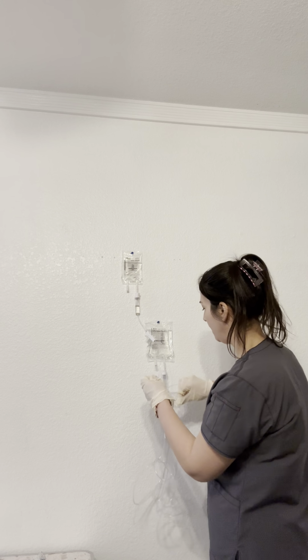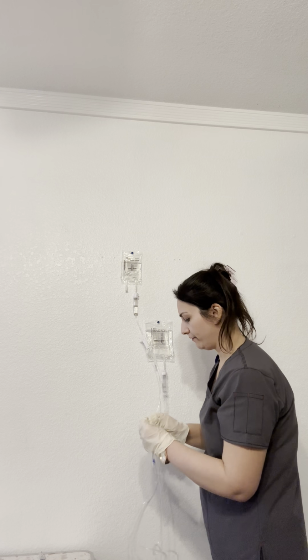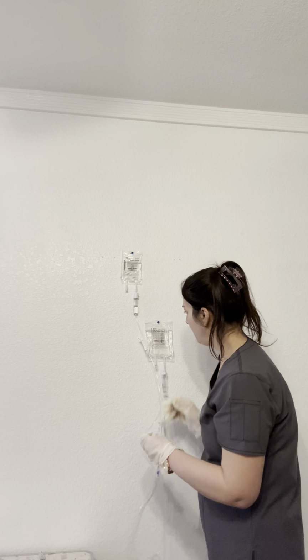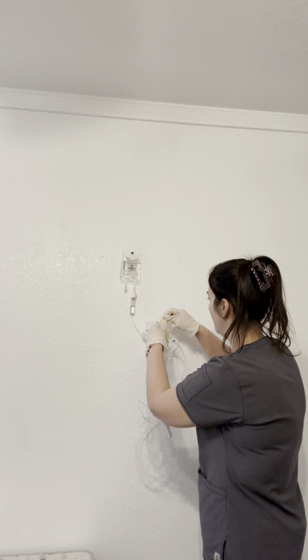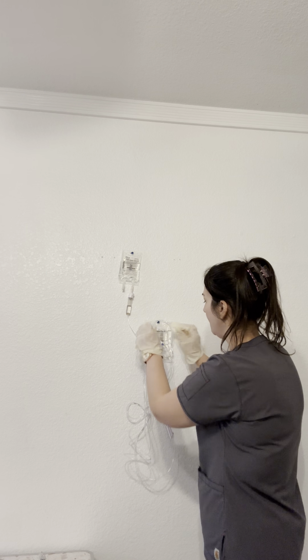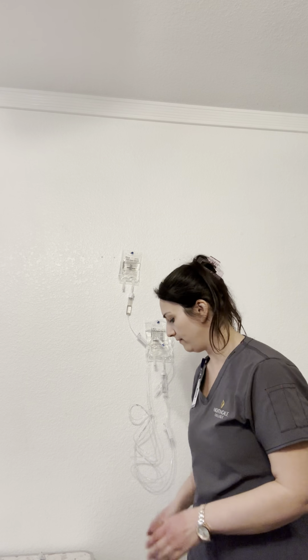Everything is hooked up here now, and I'm going to apply the cap on. Make sure this is clamped. All right, now that everything is hooked up, I'm going to make sure that the patient's IV site is in the proper location and the patient is comfortable. I'm going to clean up my area and document my results. I'm going to take off my gloves and perform hand hygiene. And we are done.